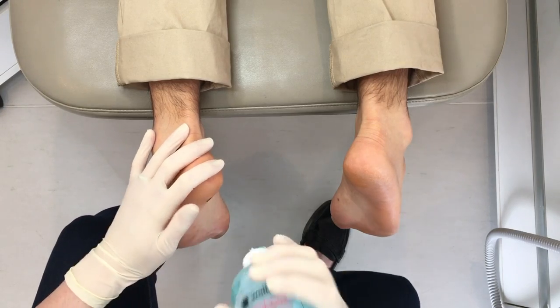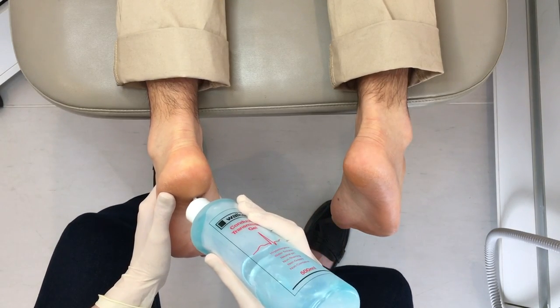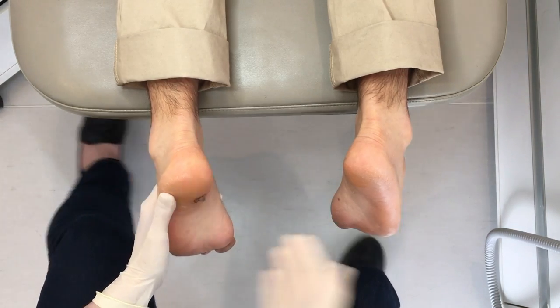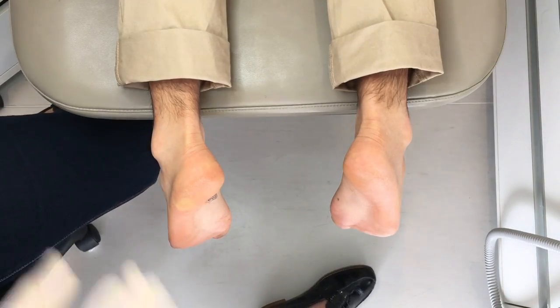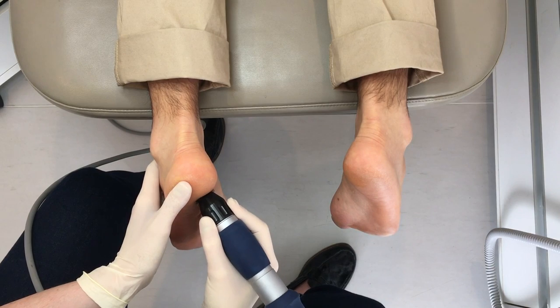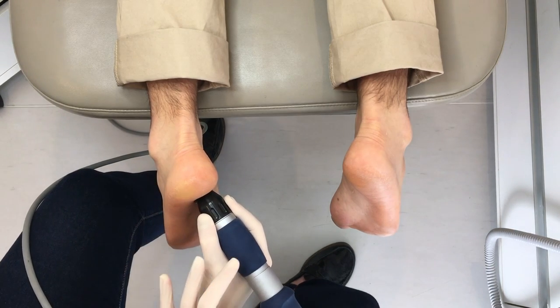I apply a bit of ultrasound gel to the site where we'll be doing the shockwave therapy. Then we're ready to start. I put the probe on the skin over the area I've marked and then we start delivering the pulses.